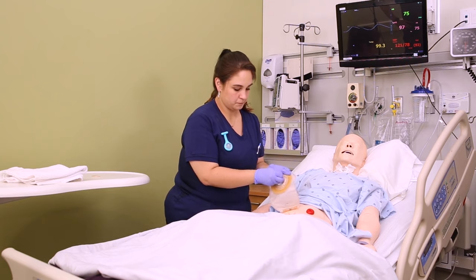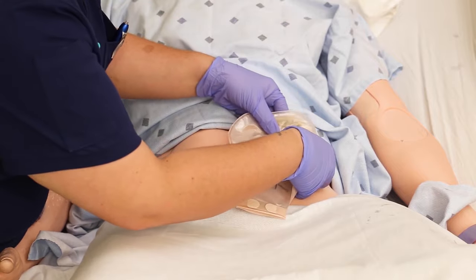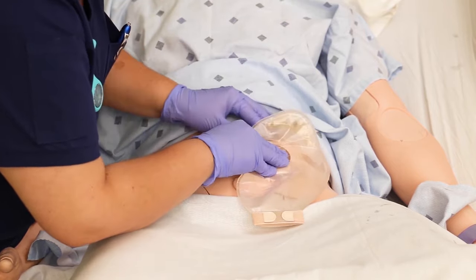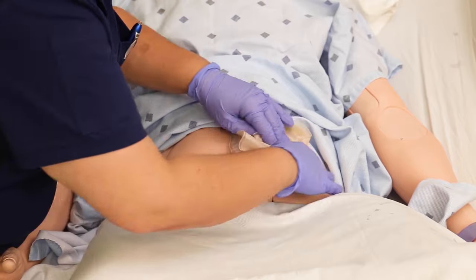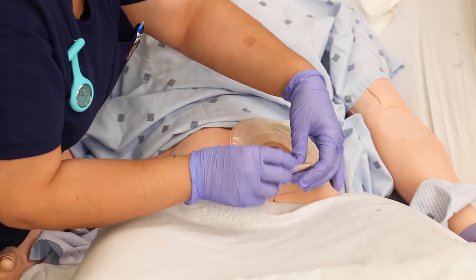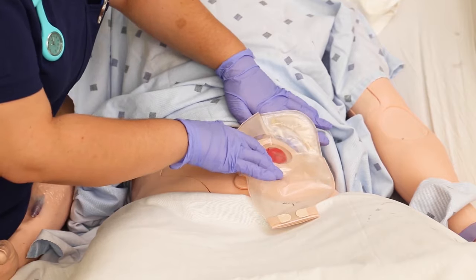If needed, apply skin prep or barrier to the skin around the stoma, then remove the backing from the wafer and apply it to the skin with the stoma in the center of the hole. For patients who've had a stoma for a long time they may have a preference for which angle they'd like their bag going — some like it going straight down, some like it going off to the side — so make sure you talk to your patient about that.